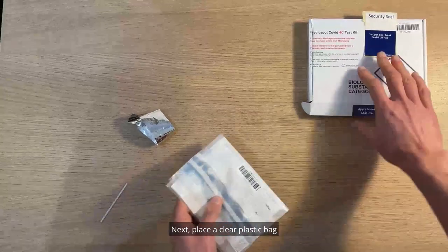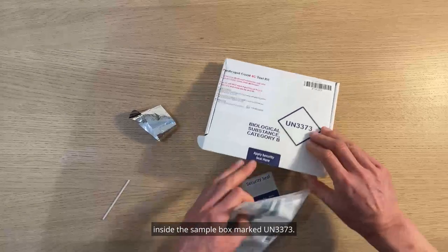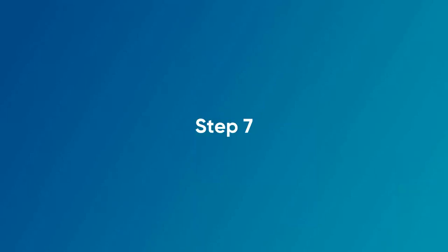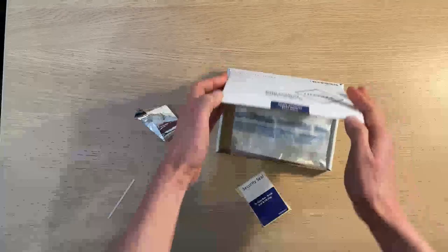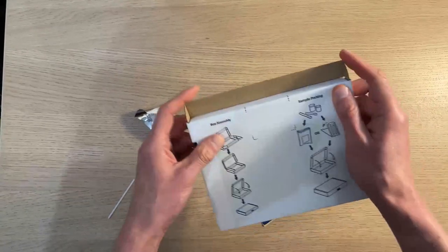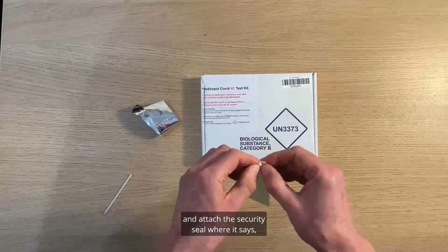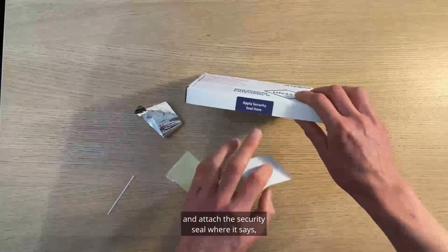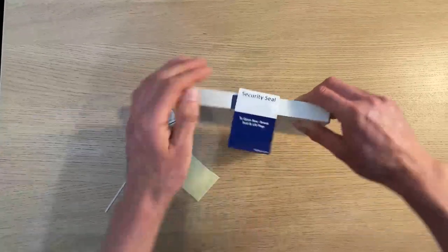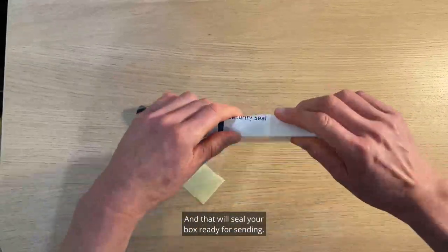Next, place the clear plastic bag inside the sample box marked UN 3373. And finally, close the box and attach the security seal where it says 'apply security seal.' That will seal your box ready for sending.